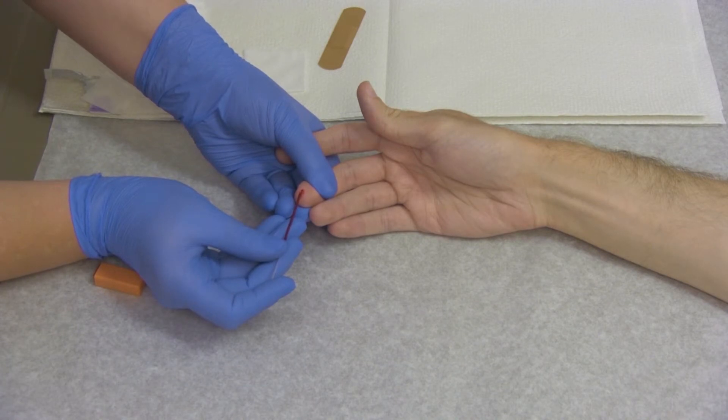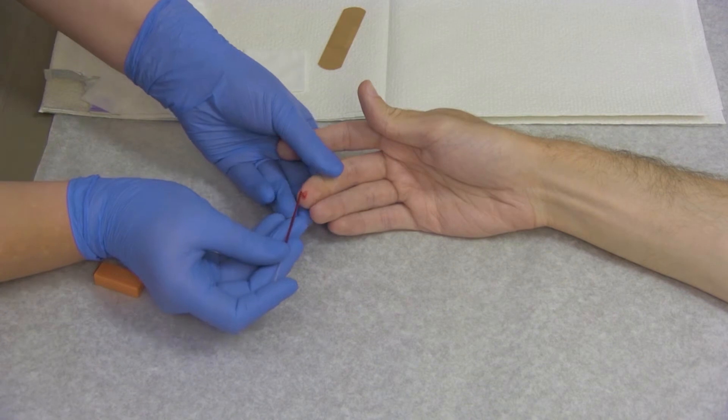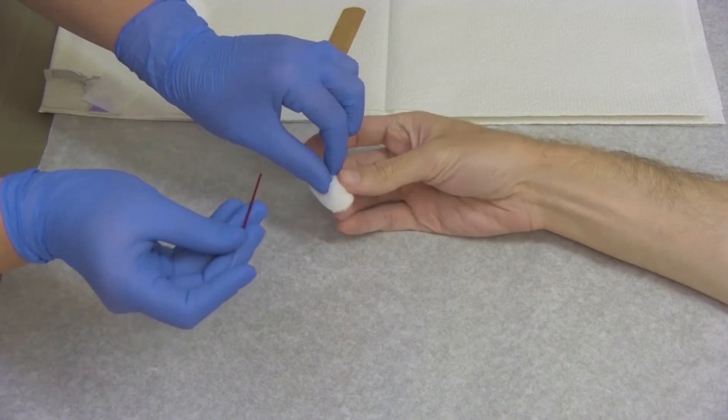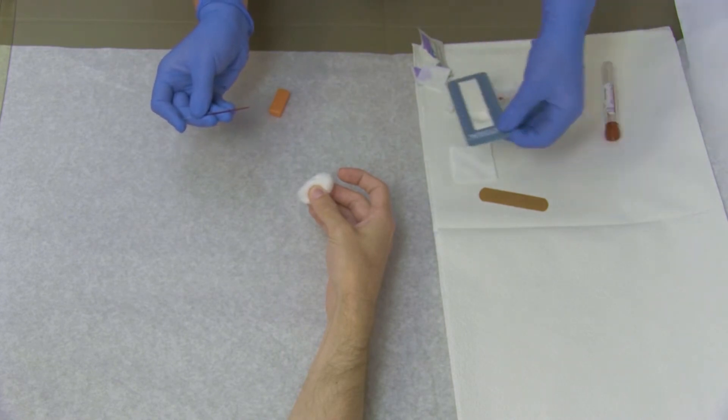Carefully wipe the residue of blood off the end of the tube that touched the drop of blood at the puncture site with a dry, sterile gauze. Gently place the end of the tube in the sealing clay tray.